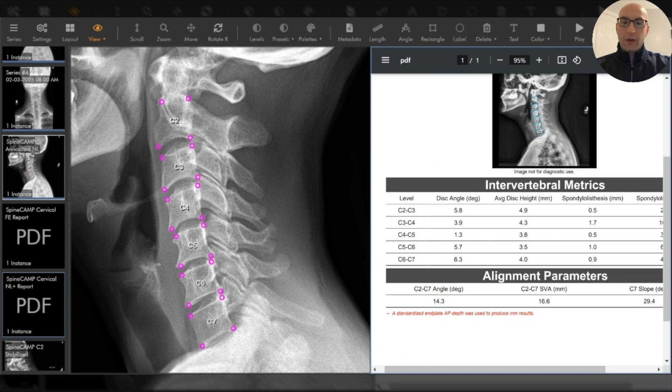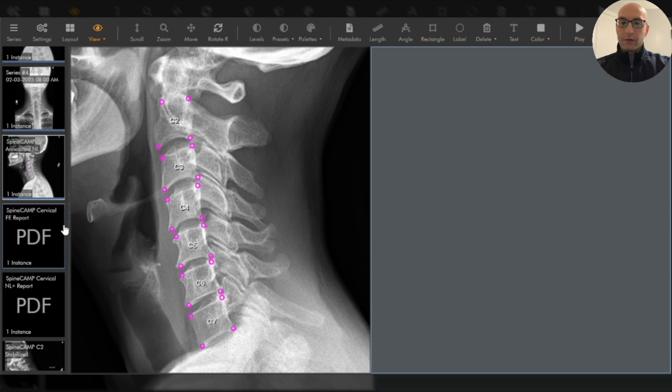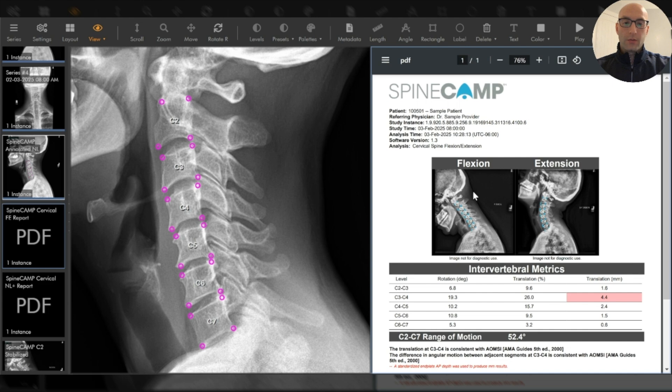On top of the static alignment analysis, SpineCamp delivers a robust assessment of spinal motion both segmentally and across the entire C2 C7 region.